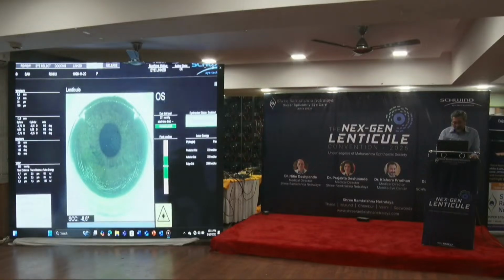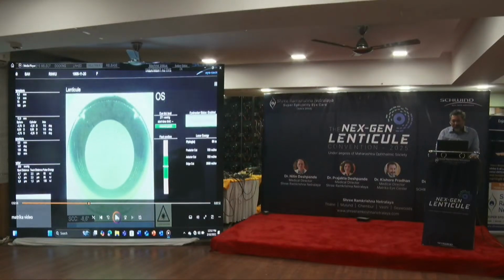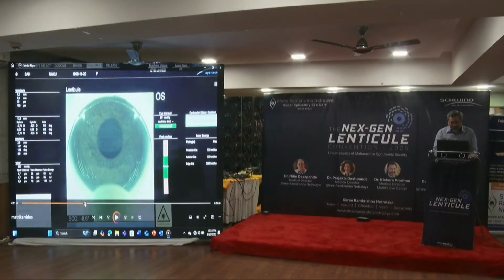So yeah, this is all, the camera is from the top. Looks very, very smooth. If you look at this, let's go back. So you have the scanning system in the microscope. So you will not see from the microscope. The VisuMax you can see from the microscope. You cannot, because the quasi-telecentric optic is in the center.